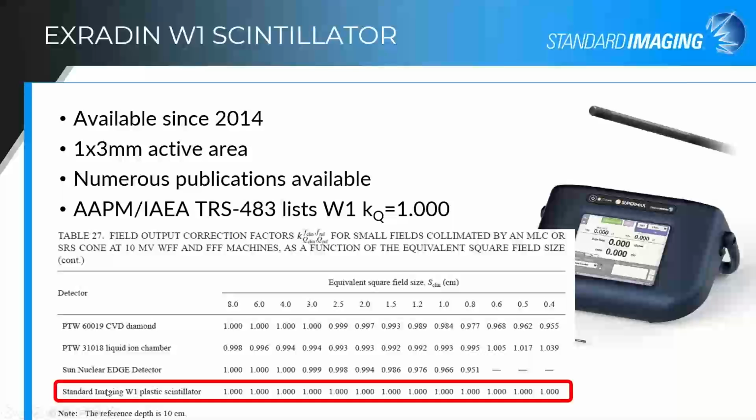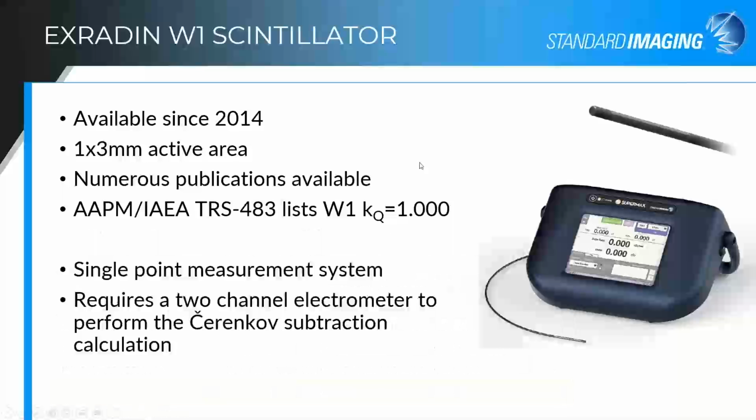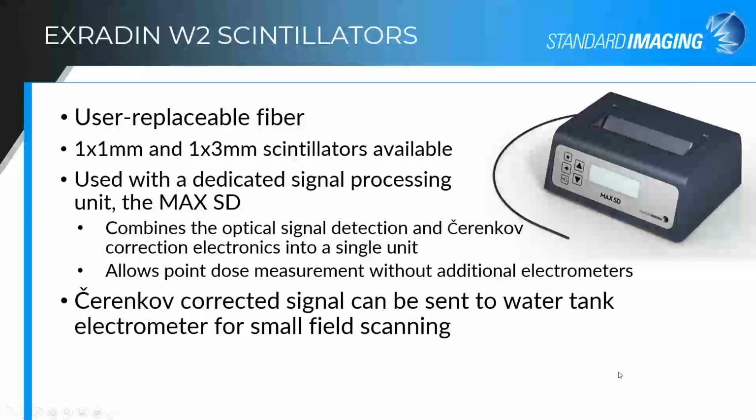And that really is the only detector within that publication that has really no correction, no effect based on that decreasing field size and the change in the spectrum. It was, however, just a single point measurement system, and it required a 2-channel electrometer like our Supermax electrometer in order to perform that Cherenkov subtraction.